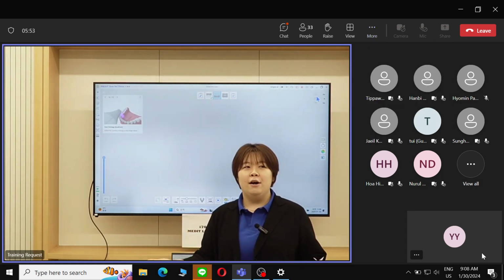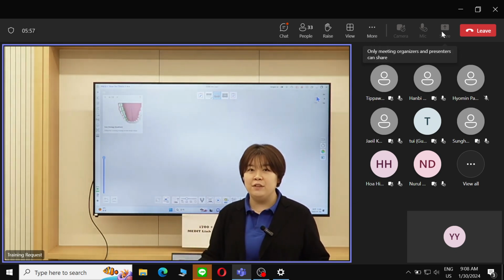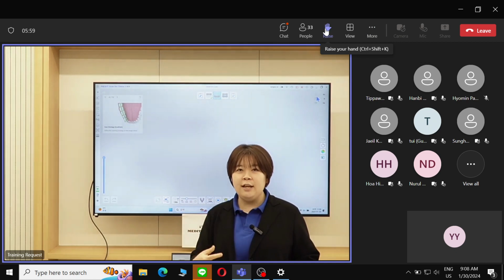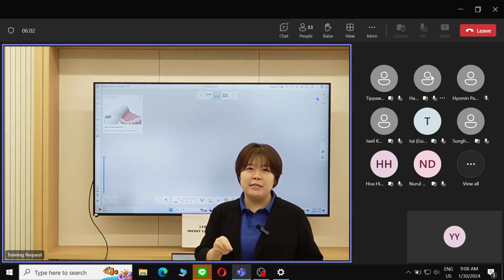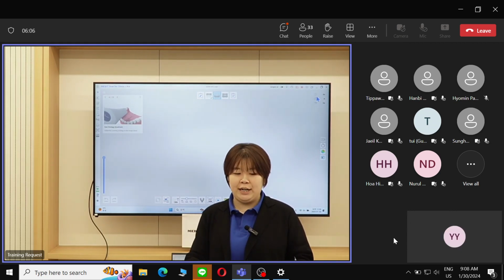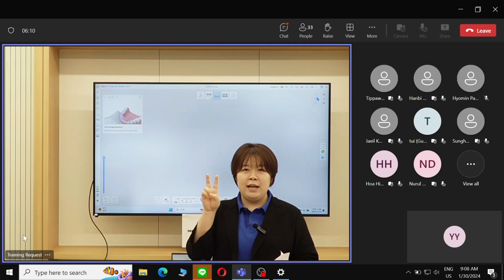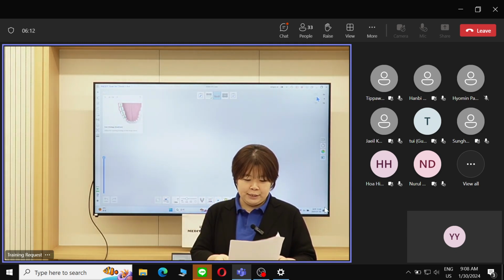It's a big enhancement compared to the previous version, which is significant enough for you to pay attention and to apply it into your local sales or marketing activities. So we hope that you will remember from today these two key points.